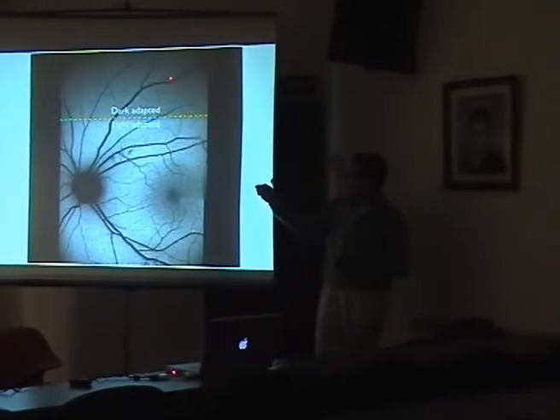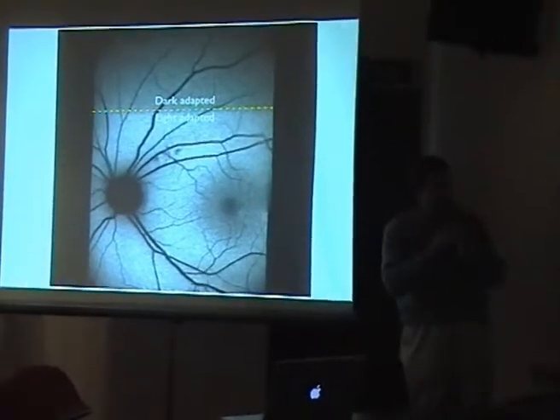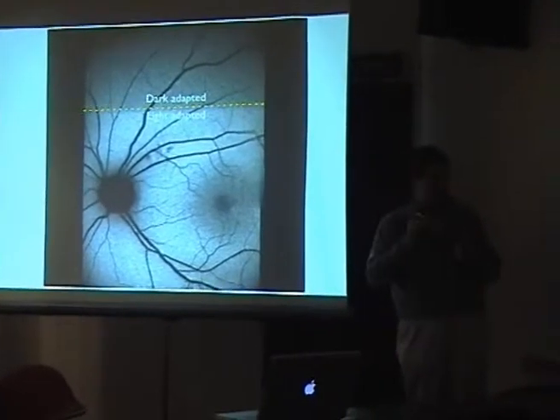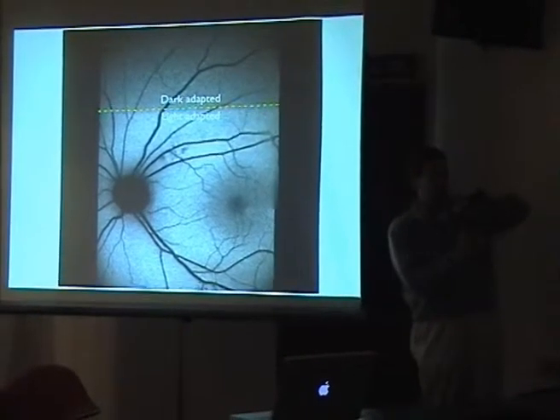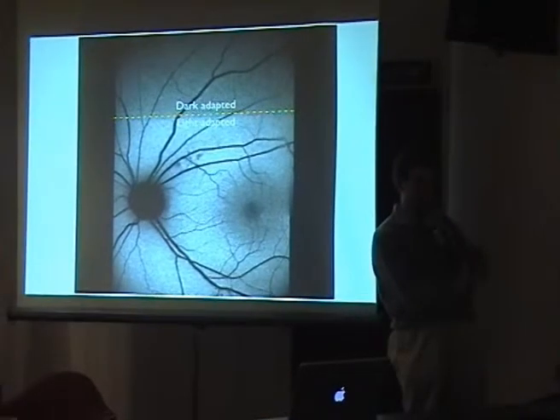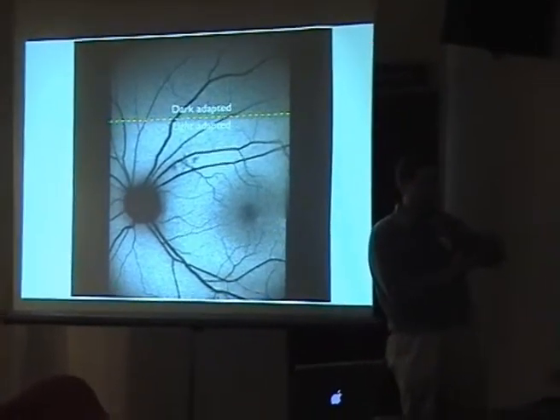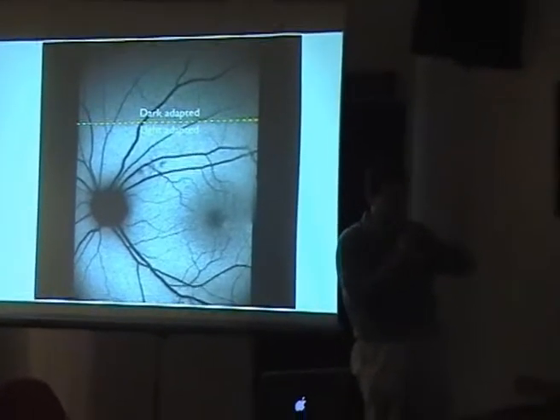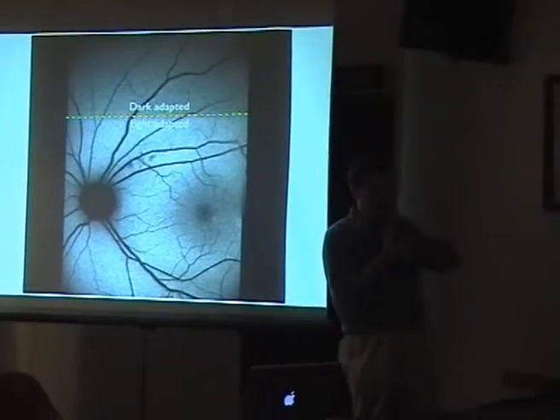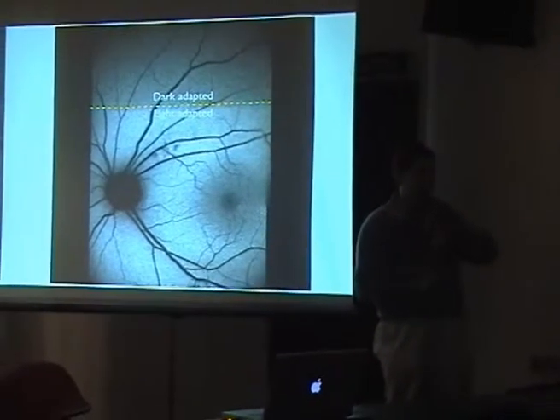So here there is still photopigment, and so we interfere with the fluorescence that comes from the RPE. The photopigment is in front of that. So we have the RPE cells that give the fluorescence, and over it there is a photopigment. If we bleach, we see more fluorescence that comes from the RPE. If not, it's dimmed a little bit.